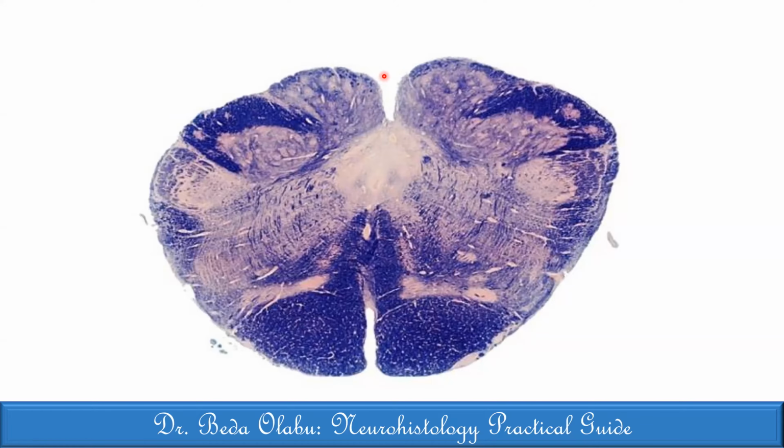I'd say this is the closed medulla above the point of motor decussation. The structures have been correctly identified by my colleagues. The pyramids are ventral. Where the pointer is currently, that's the medial lemniscus forming. You can see the arcuate fibers are actually coming towards the medial lemniscus. And as we go, you can see there's a pericentral gray and the central canal, which now indicates this is the medulla.